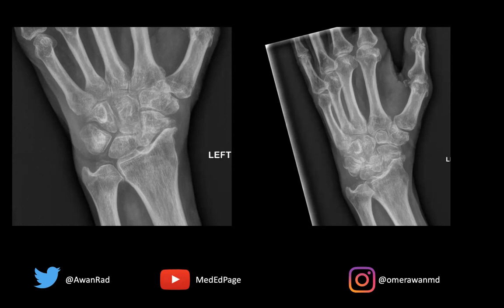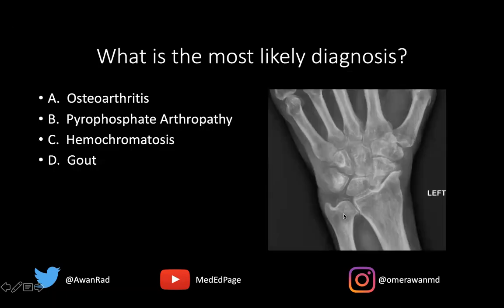We have two views of the left wrist here, and there are definitely important findings. The question is: what is the most likely diagnosis? Is this a case of osteoarthritis, pyrophosphate arthropathy, hemochromatosis, or gout?